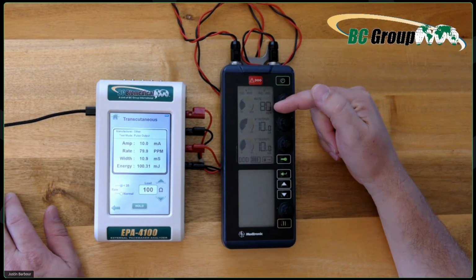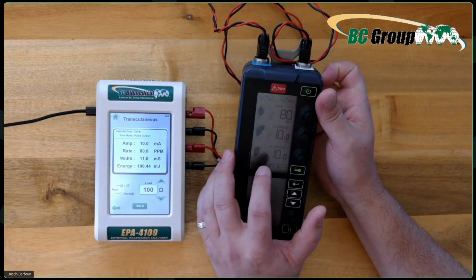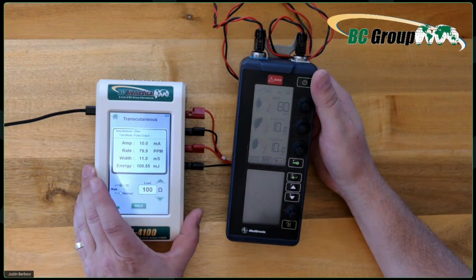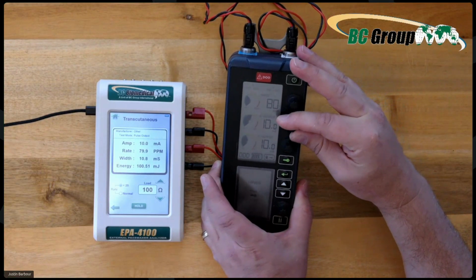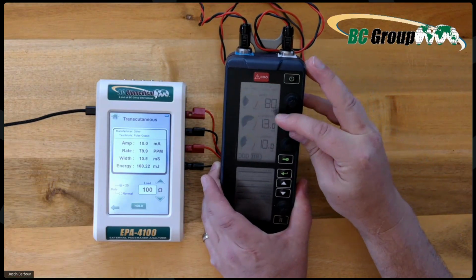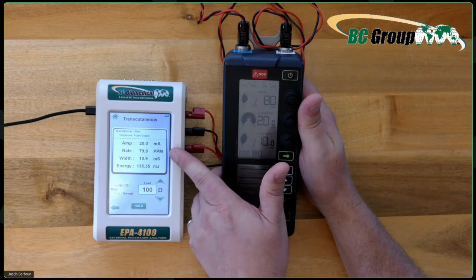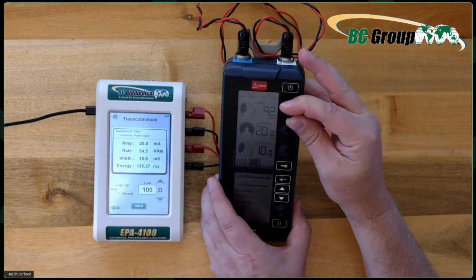Over here, I have 80 ppm. I've got atrial 10 milliamp, and I've got ventricle 10 milliamp. But because of the mode that we're in, it's only sensing atrial at the moment. So as I turn up this dial, it is locked. Of course it is. As I turn up the dial, you'll see the milliamps increase on the screen, and you'll also see the ppm increase over here when I turn up the pulses per minute.